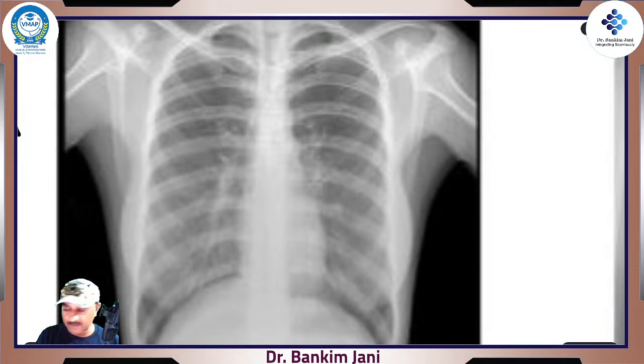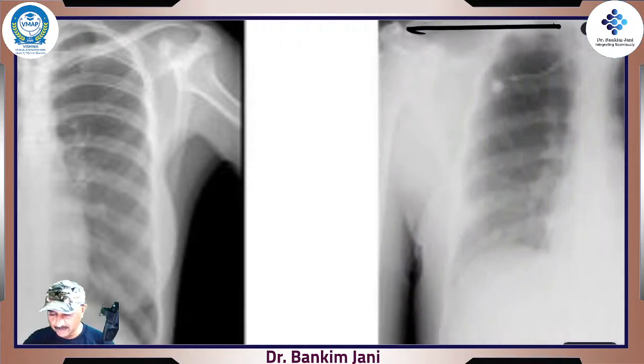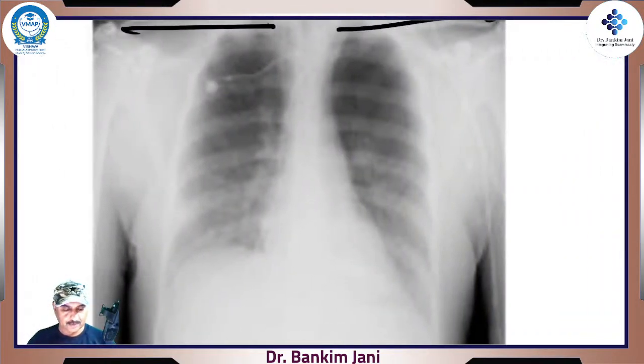Now see the anterior ends and posterior ends, right? Anterior ends, they are seen. Compare it with this. Can you see the anterior ends? So difficult, because this is AP view, right? So, anteroposterior, so the posterior ends will be seen more clearly. The anterior ends are not even seen properly, right? Though some of the ends are seen, they are blurred because they are far, right?